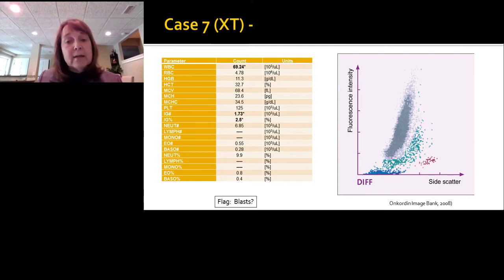At this point, these are likely my neutrophils and perhaps some immature granulocytes, but the analyzer can't tell what this is, so it's graded out. You're going to guess it's in the area of lymphocytes and monocytes, so it's likely lymphocytes or monocytes, or both. And it is pretty high up on this scale, so we question whether there might be blasts there as well. So here it is as far as numbers go, and indeed, a very high white count, typical of leukemias. Okay, a 69,000 white count.